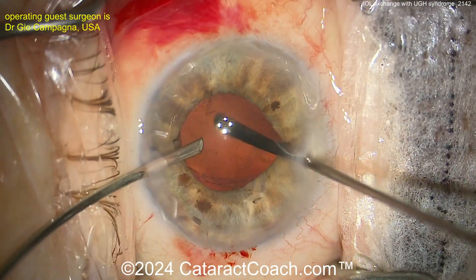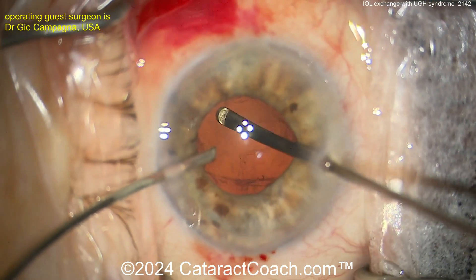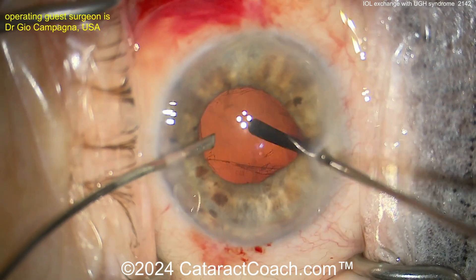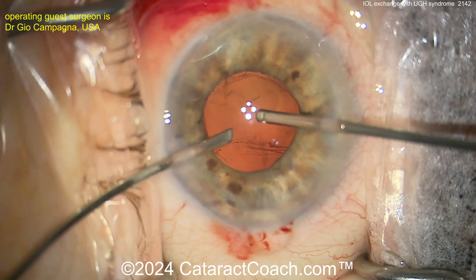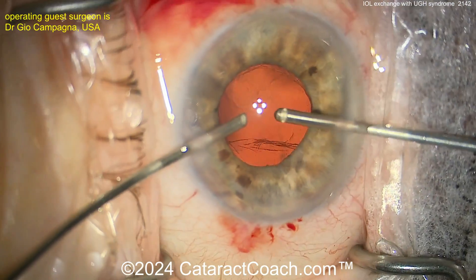Now, time for a vitrectomy — you've got to do a vitrectomy. A little bit of triamcinolone can help stain vitreous if you need to. You definitely want to do a vitrectomy here because, undoubtedly, in taking that lens out, you did get some vitreous prolapse.